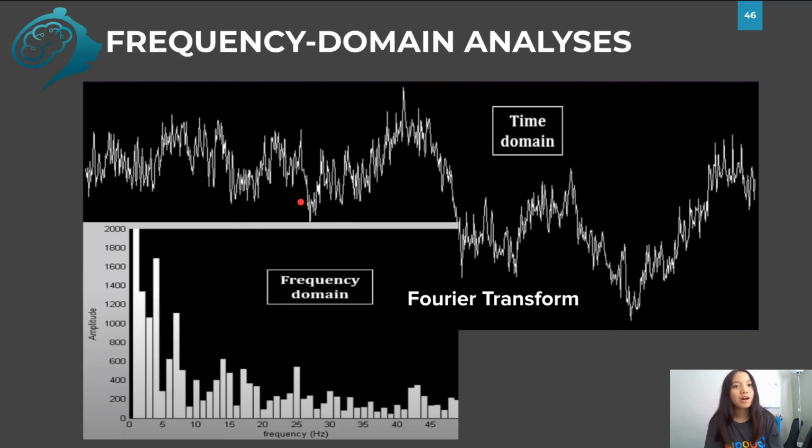But from this plot, with only the frequency domain, it is not possible to determine whether the 8 hertz component is constant over time in the EEG signal, or whether there is a very strong one in the very beginning, or whether it appears in short bursts, and so forth. So we can get none of these temporal dynamics in these plots, but in fact, these temporal dynamics are things that we should be interested in because the brain is very dynamic.